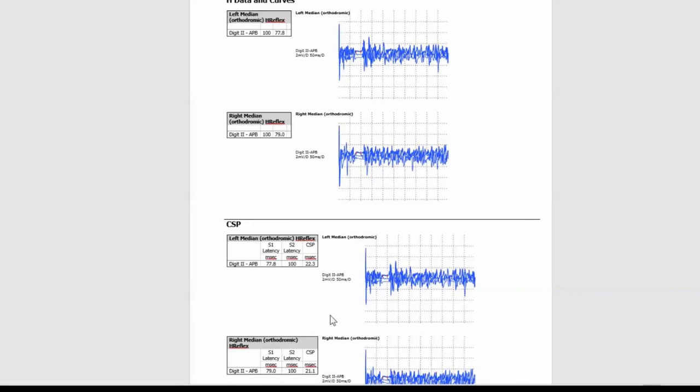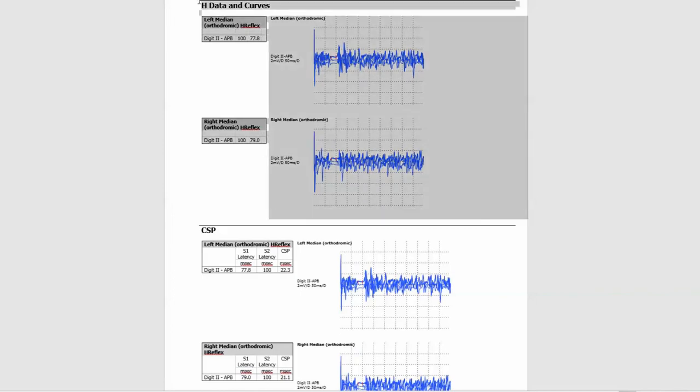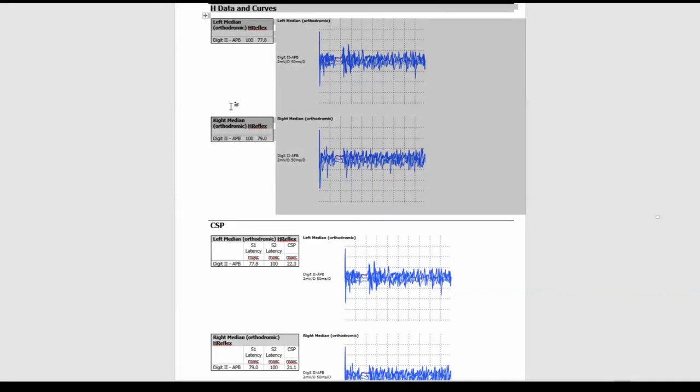All you simply have to do now is to select H data and curves from that aspect and that element of the report and delete it. And there you go. That's your cutaneous silent period all sorted.